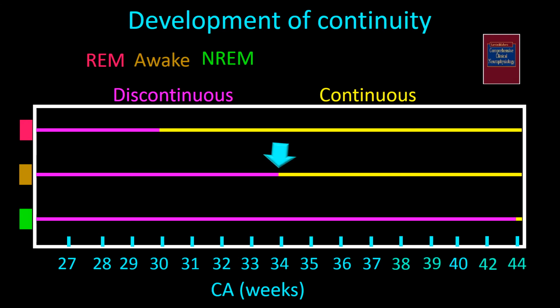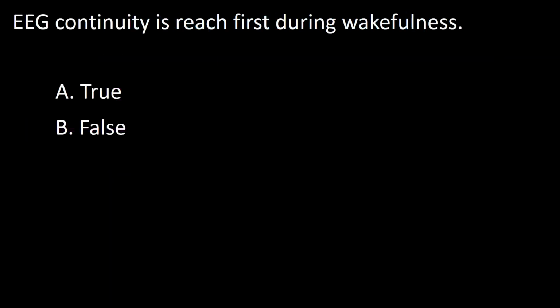During wakefulness, discontinuity disappears by 34 weeks, and during quiet sleep by 44 weeks conceptual age. So the answer to this question is false.